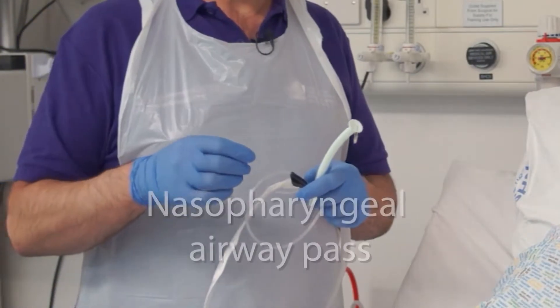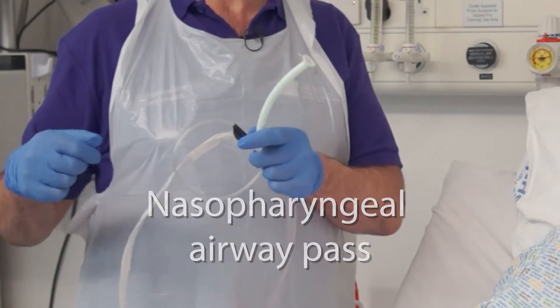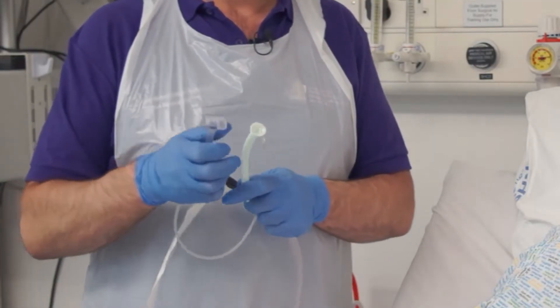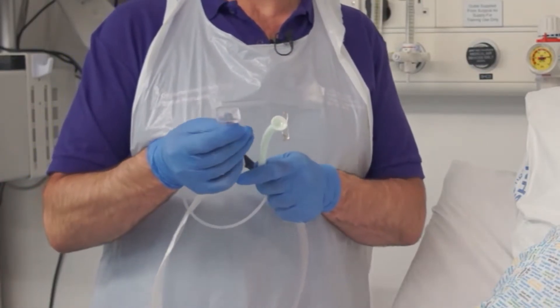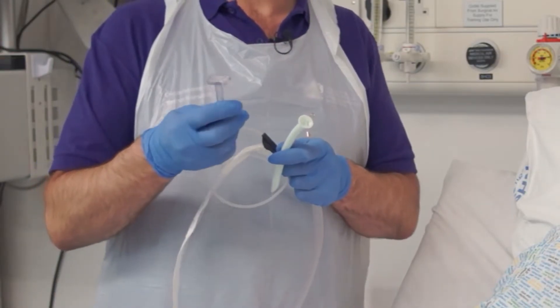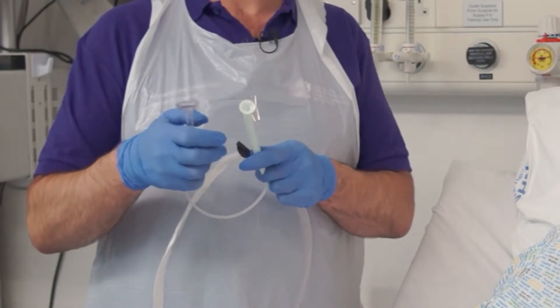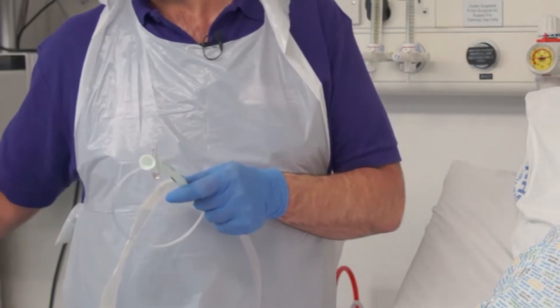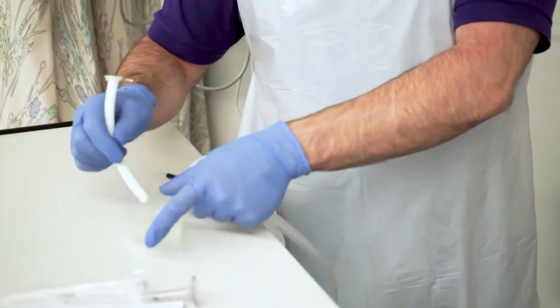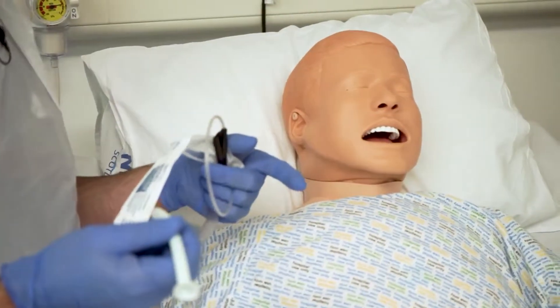If repeated attempts at nasopharyngeal suctioning are required, it may be less distressing for the patient to have a nasopharyngeal airway passed. They come in a variety of different types — some with a retainer pin and others with a wide flange to prevent inhalation. Sizing is a size 6 for a female or a small man, and a size 7 for a large lady or most men. They need to be lubricated with a water-soluble lubricant.